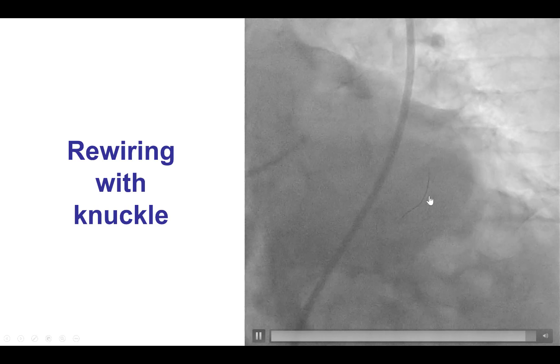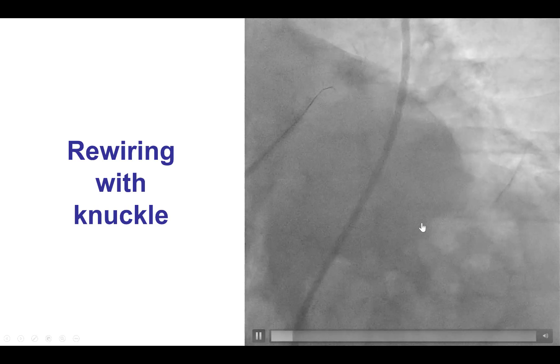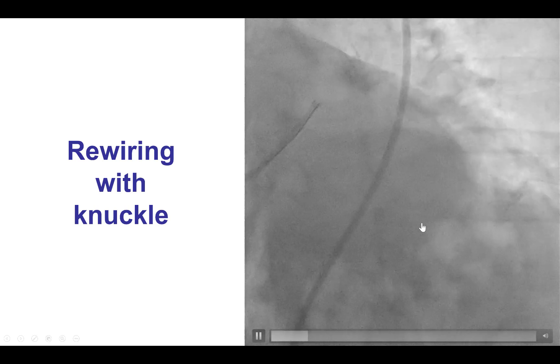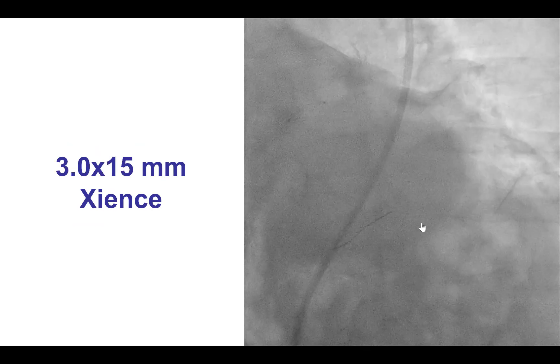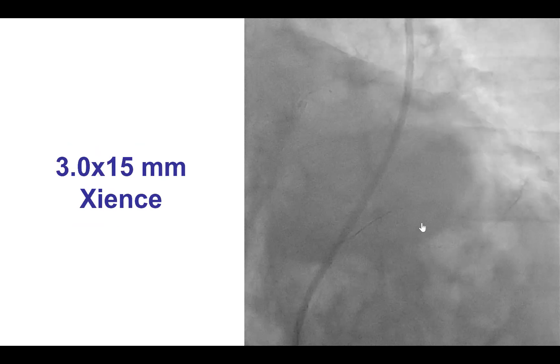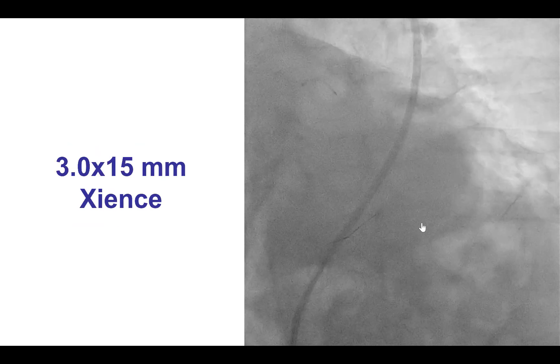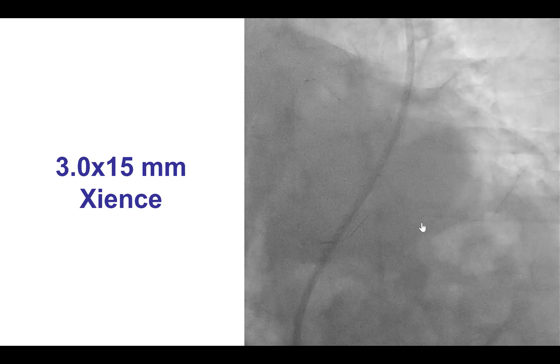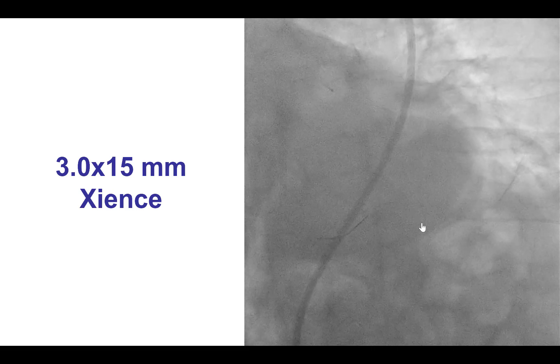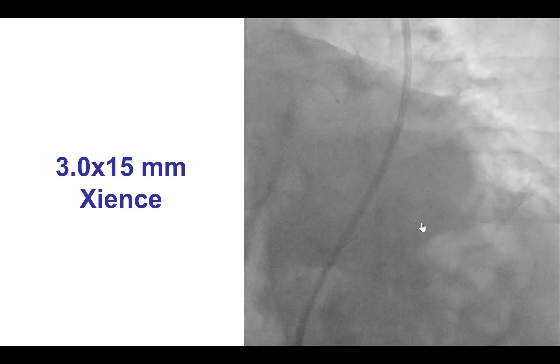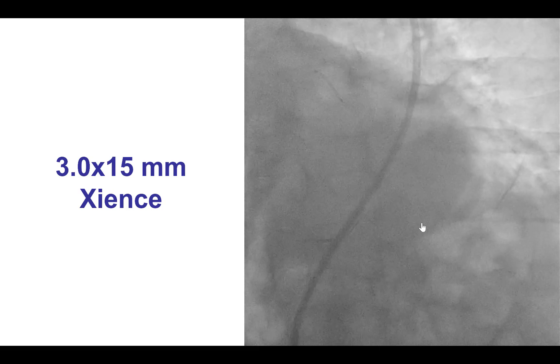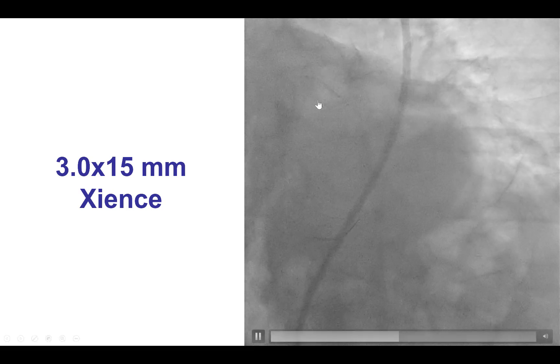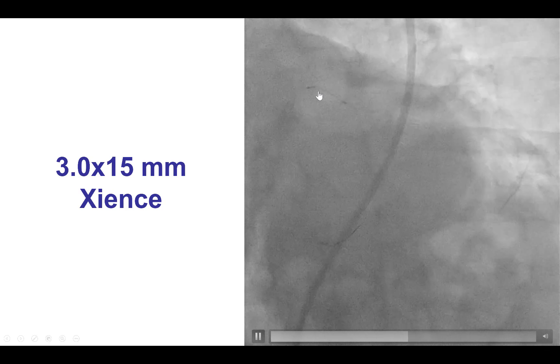Once again, we formed the loop, and that advanced distally into the vessel. Because there was no significant disease anymore at the origin of the obtuse marginal, we decided to not place a wire into the obtuse marginal, and we did additional attempts to deliver the stent.